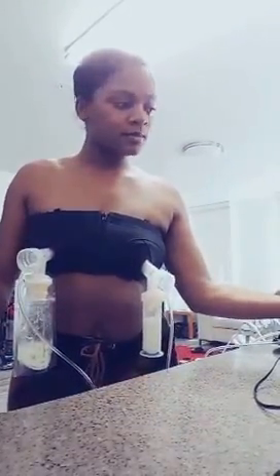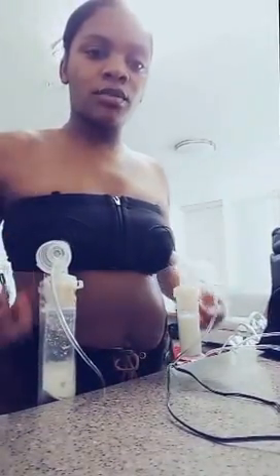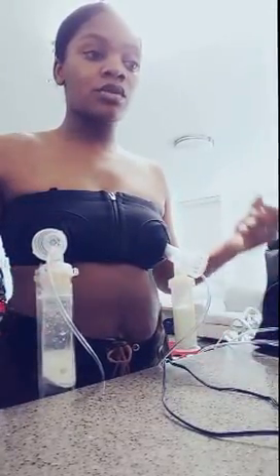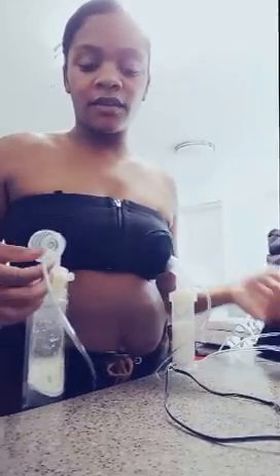So what I'm going to do now is turn off my pump and disconnect everything. But before I do that, if you feel like your milk is coming down midway through pumping, you can always use the letdown button, which is right here. Select that, and it will start pumping at a different pumping rate because it knows that your milk is let down. It's going to accommodate that feeling. So right now I'm going to turn everything off.